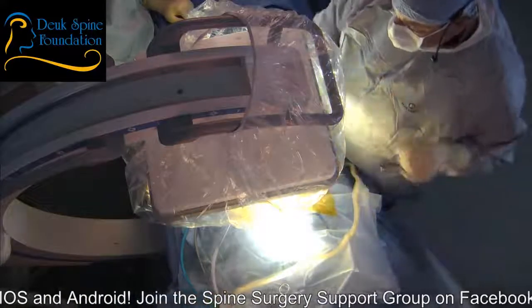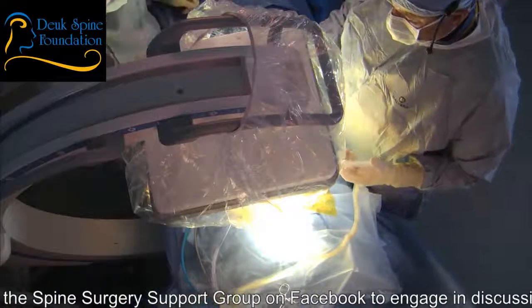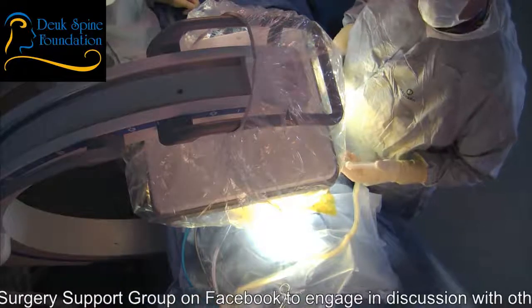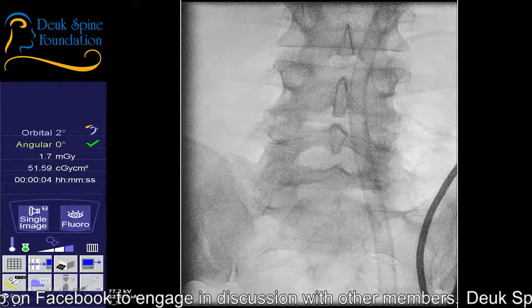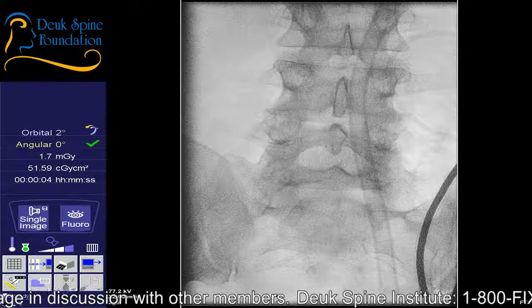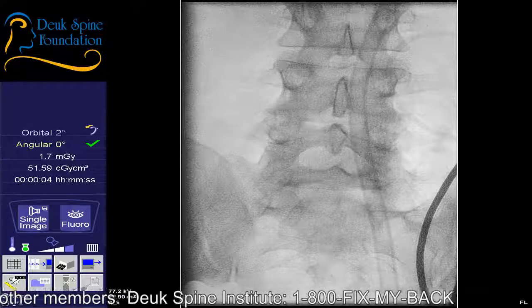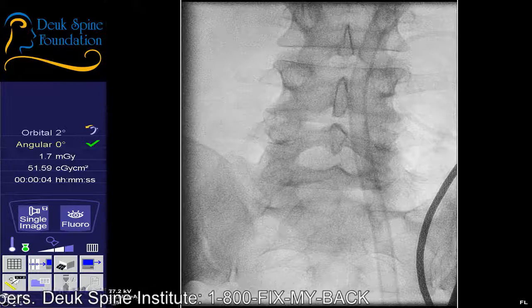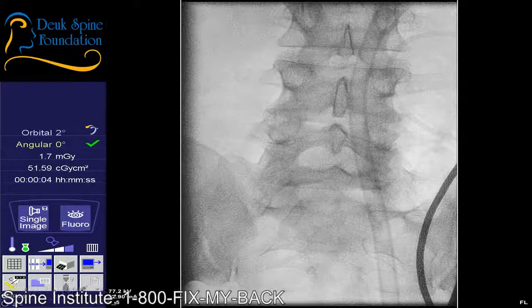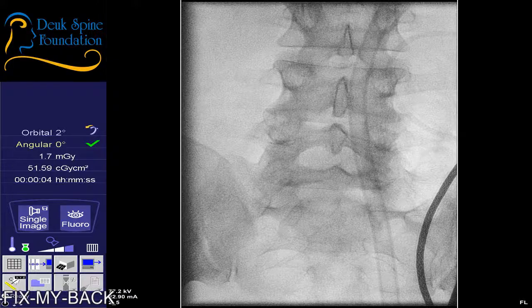Remember, if you feel a lot of discomfort, you just say, ouch. And I'm going to do my best to give you some more numbing medicine and make it better, okay? Shot. I think I'm a little too low. Just try to relax. If you feel pain, just say ouch, and we'll do something about it. I've been giving you more numbing medicine to try to make it more comfortable for you. You feel anything there? How's our blood pressure? Okay, listen. I need you to pull them down. 20 points. Okay, 20 points.